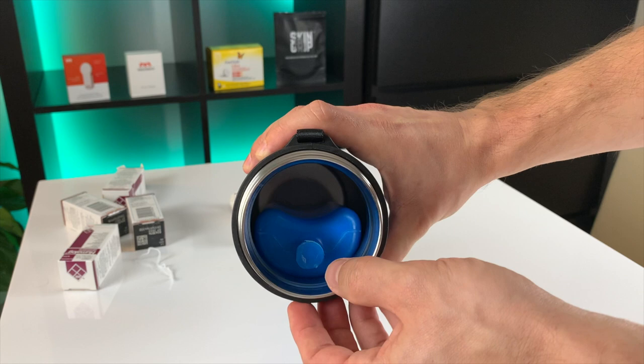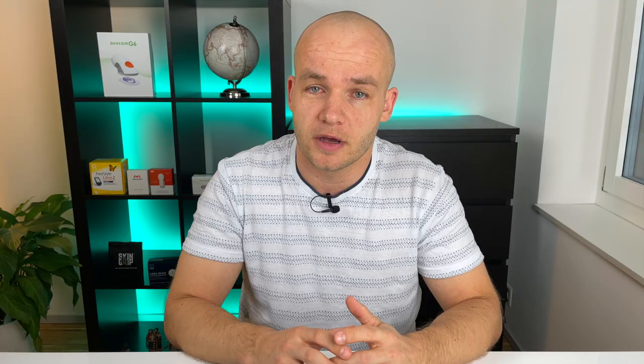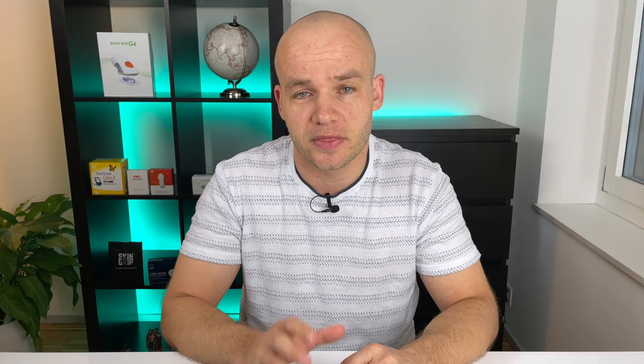So how much supplies can you squeeze in? The ice pack takes up about half of the space in the cooler, but the whole cooler is quite big. I have an insulin pump, so I only carry a few insulin vials when I travel, and there is more than enough space for at least eight of them. And if you are using insulin pens, you can comfortably put in two of them along with a few insulin vials. If you want to put in even more medical supplies, you might consider taking out the ice pack, but you will lose a little bit of the cooling function.